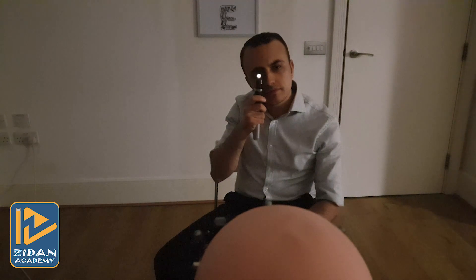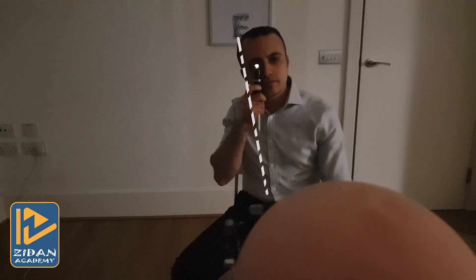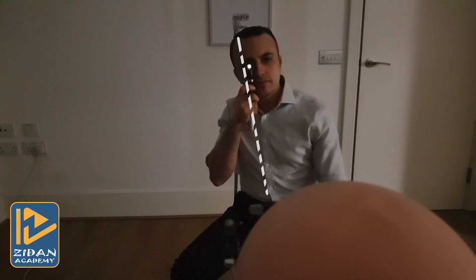For examining the patient's right eye, you should use your right hand and your right eye, sitting to your patient's right-hand side. For the left eye, you need to be situated to your patient's left-hand side, holding the retinoscope with your left hand and using your left eye. This allows your patient to look past your ear at the fixation target with the eye not being refracted, to help in relaxing accommodation. Ask your patient to tell you if you start to block their view of the fixation target.